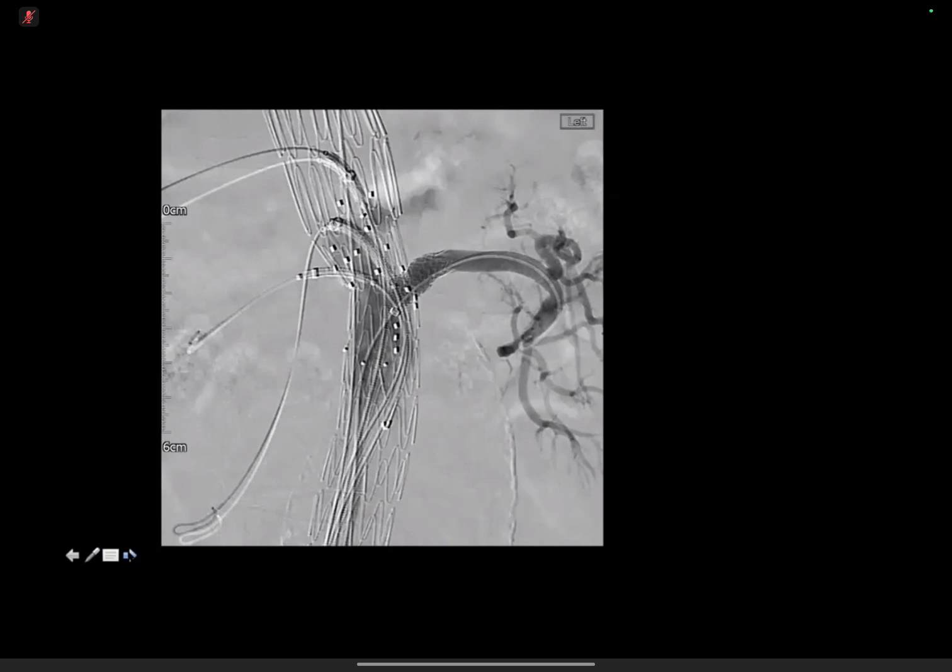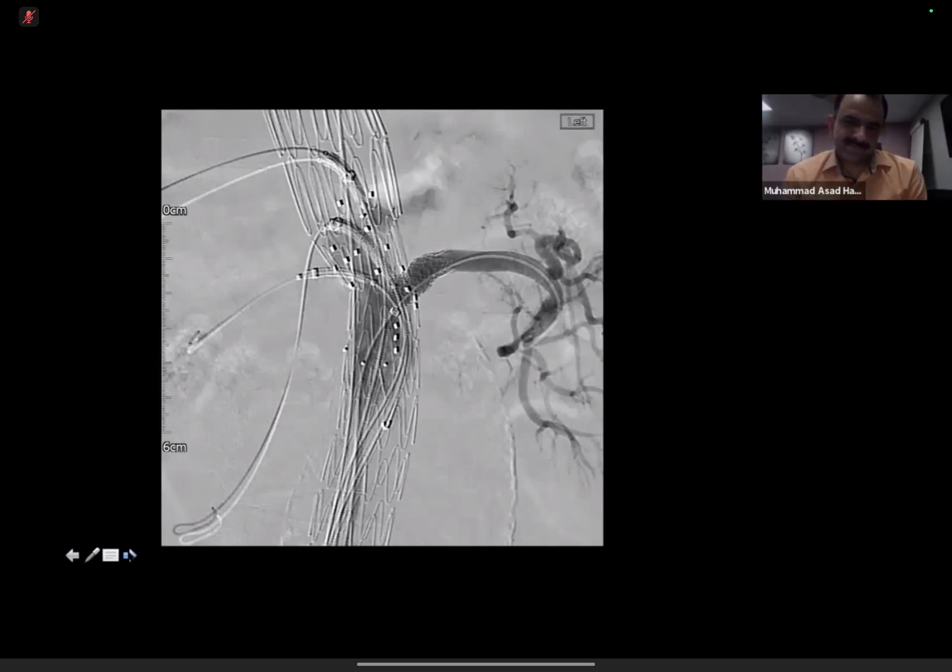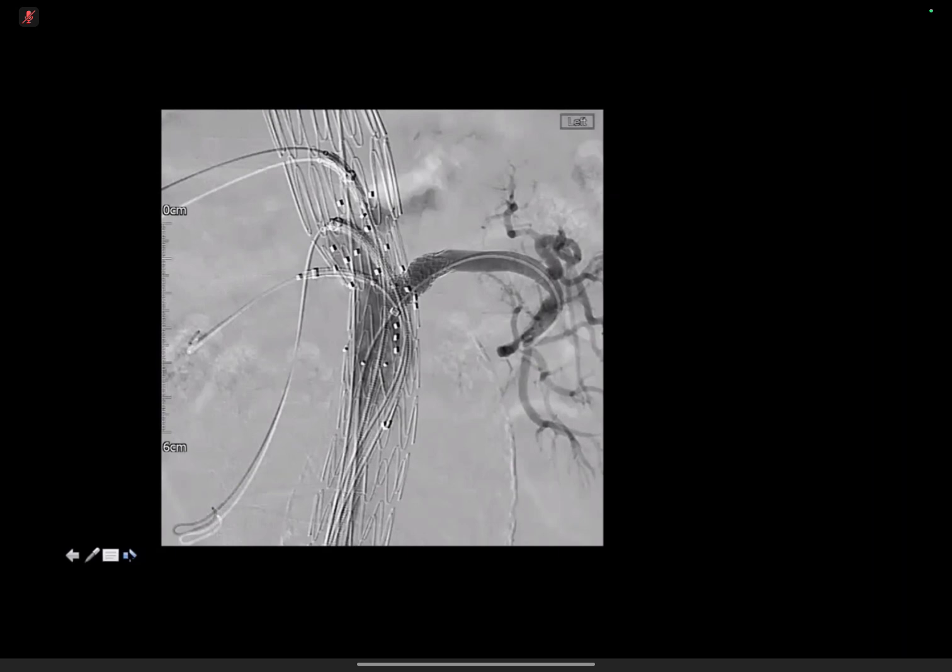There also appears to be wires or part of the stent which appears to be extending externally. I'm not sure if that's normal or not. I can also see some contrast superior to the branching vessel. I'm not sure what that represents.